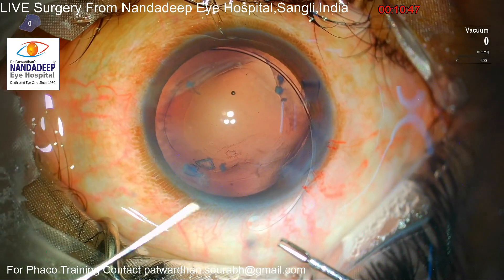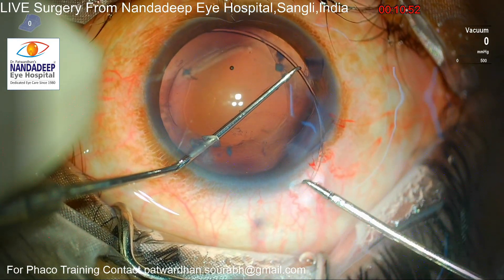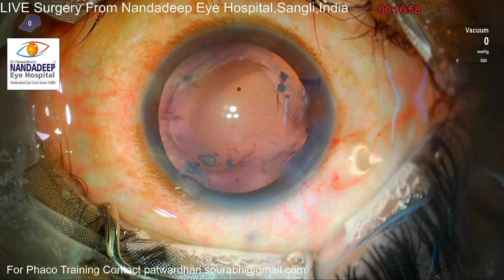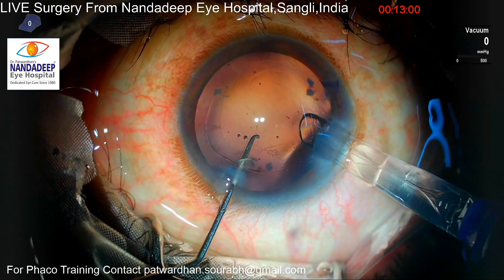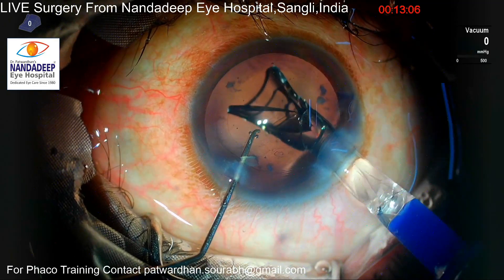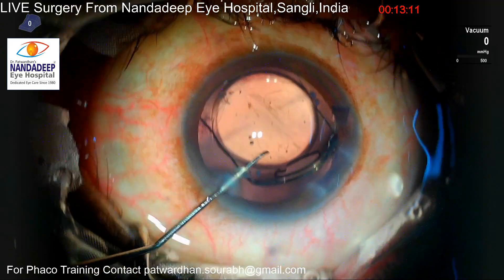Those fibrotic plaques are sometimes strongly adherent with the capsule, and trying to remove them excessively might pull the zonules. So I am going to insert a capsular tension ring, because I want long-term stability of this IOL. I observe some fluid going into Burgers space — there might be some zonular weakness from the trauma as well — so I want the capsular tension ring to support the bag and bring the anterior and posterior capsules closer to each other.